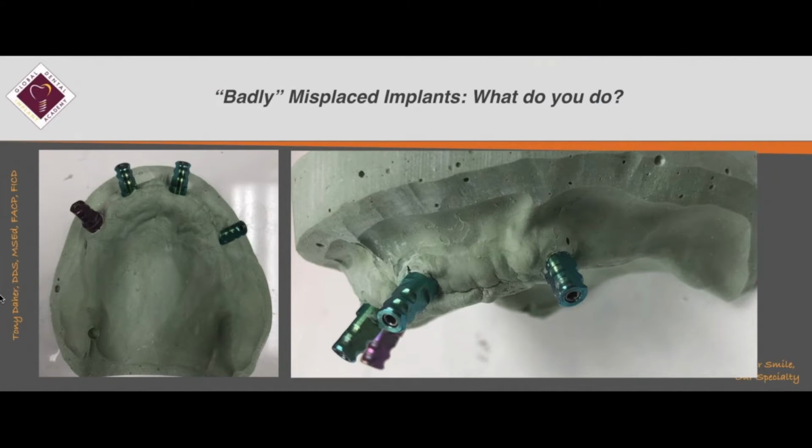Badly misplaced implant, sometimes it happens. I don't know what the surgeon is doing here, or perhaps a problem with eye-hand coordination. And this is what happened, and you have 4 implants. And this is why I'm a prosthetist. So all these problem cases, they come to my practice.